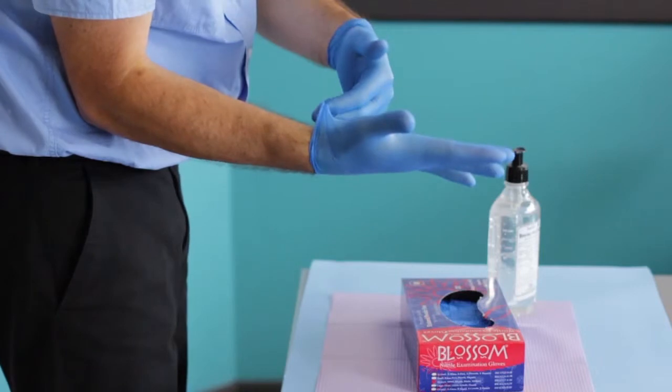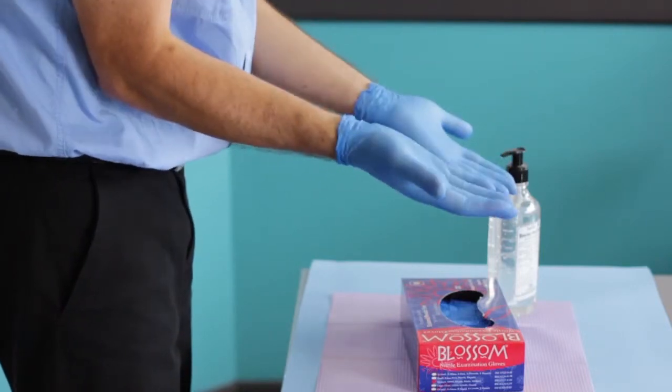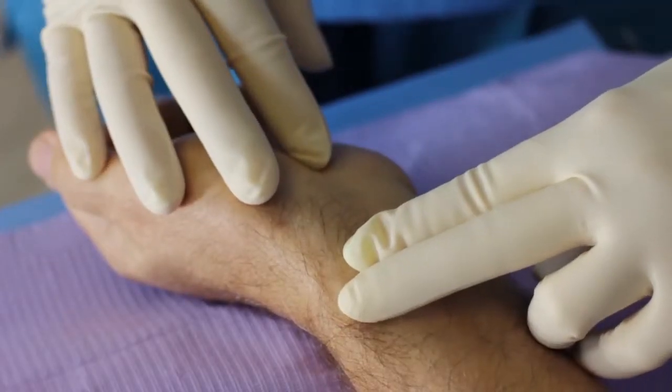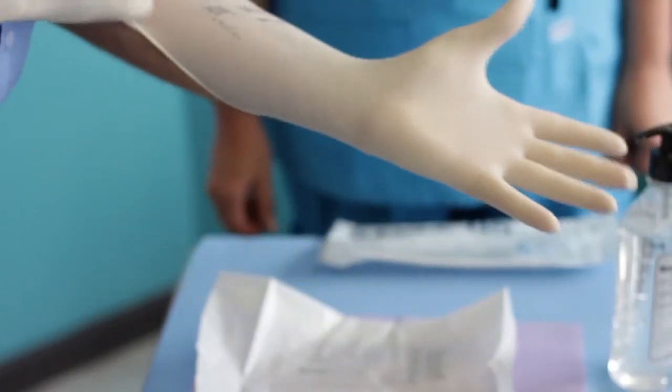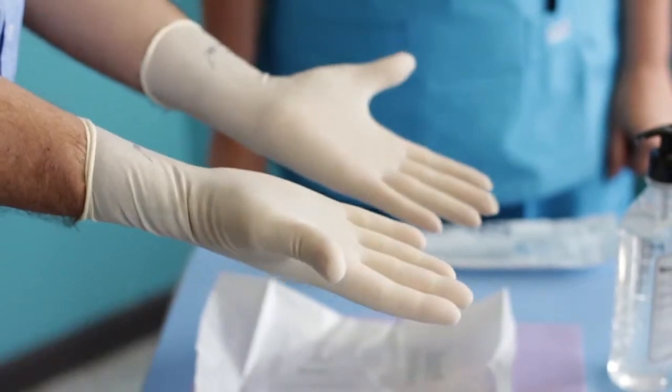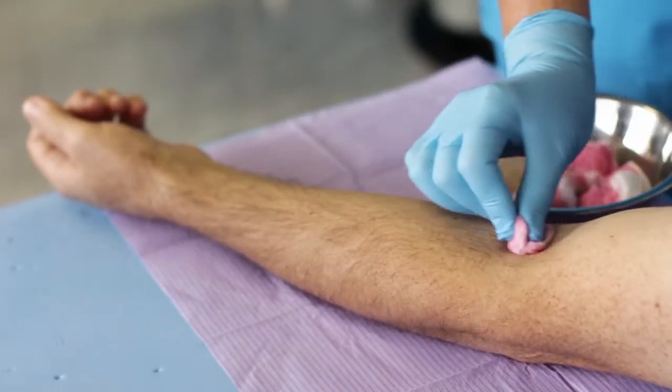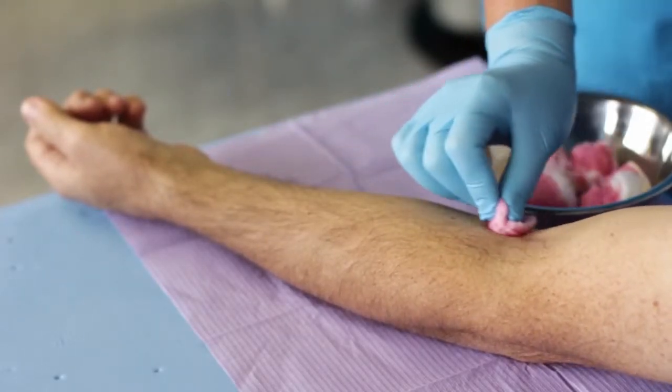Do not touch the venipuncture site after skin preparation. If palpation is absolutely necessary after skin preparation, then sterile gloves must be used prior to palpation. Using swabs saturated with 2% chlorhexidine and 70% alcohol, disinfect the venipuncture site with a scrubbing motion.